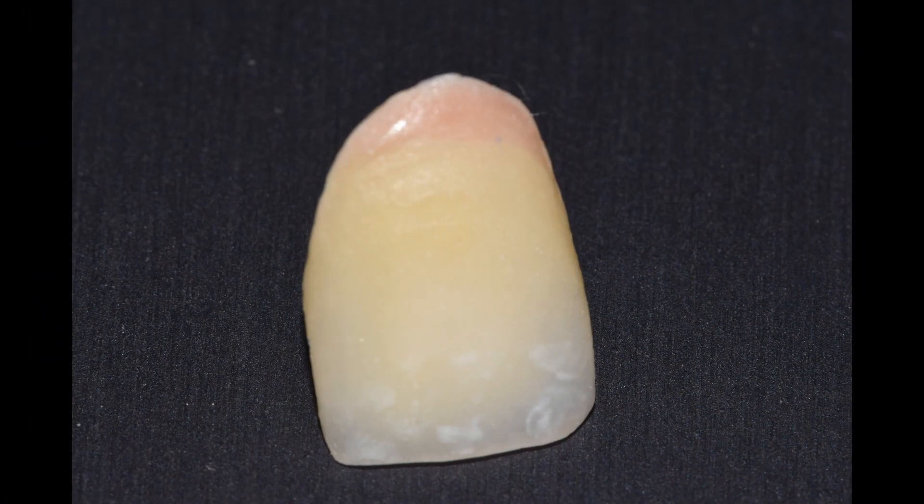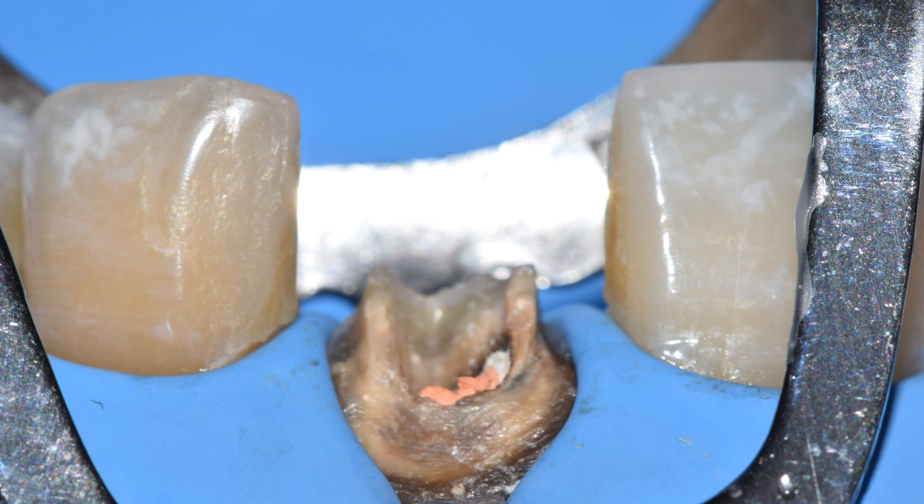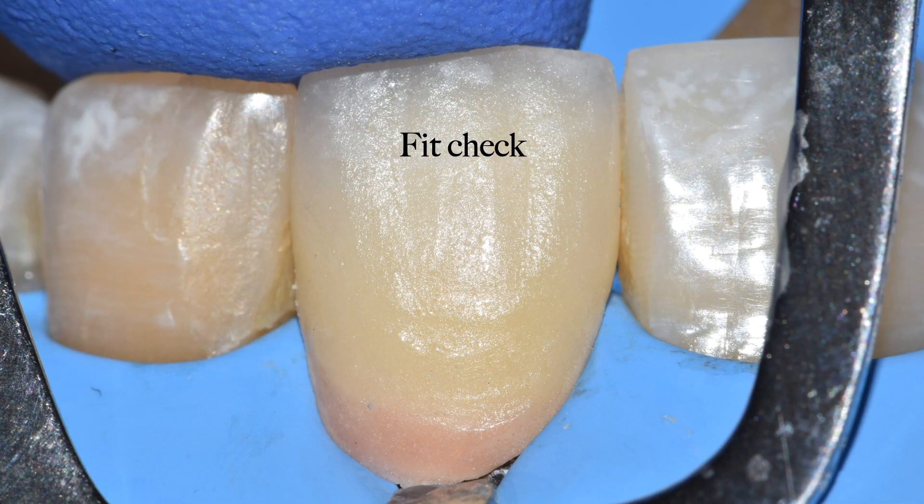This is the zirconia crown that was fabricated from the lab. A very important element that determines success of this procedure is rubber dam isolation. Rubber dam isolation plays a very critical key because when it comes to bonding, we need that perfect isolation so that the new core bonds well to the underlying tooth structure. We already have an online rubber dam course, the link of which is on the top of your screen. Once I have made an anterior quadrant isolation with a 212 clamp on the left central incisor, before starting anything, I am doing a fit check of the prosthetic crown because I don't want my clamp to interfere with the fitting of the crown once I place the core material inside the tooth.